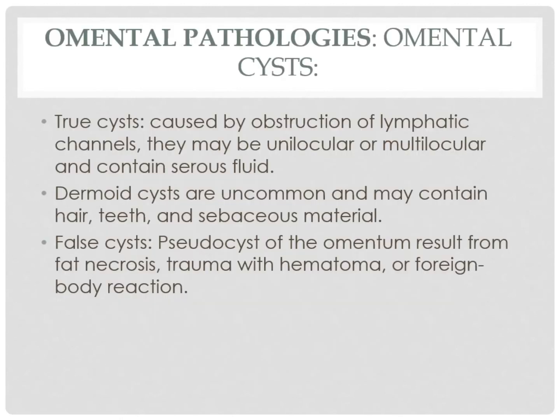Omental pathologies now. We have omental cysts, also a rare condition. We have true cysts and false cysts. True cysts are caused by obstruction of lymphatic channels. They may be unilocular or multilocular and contain serous fluid. Dermoid cysts are somewhat uncommon and may contain hair, teeth, and sebaceous materials. Now, also false cysts, like pseudocyst of the omentum, result from fat necrosis, trauma, or hematoma, or foreign body.